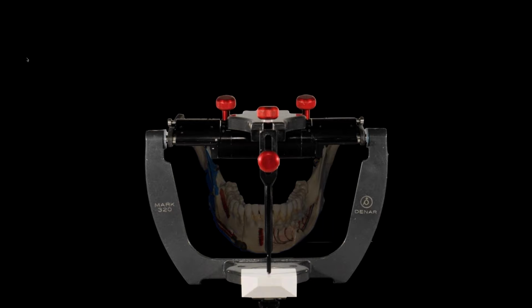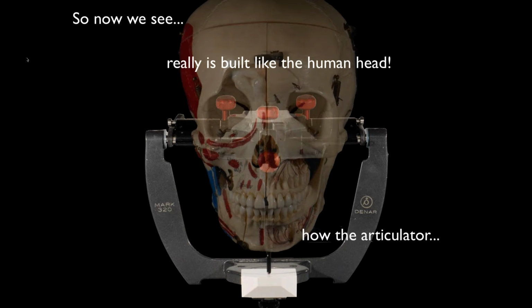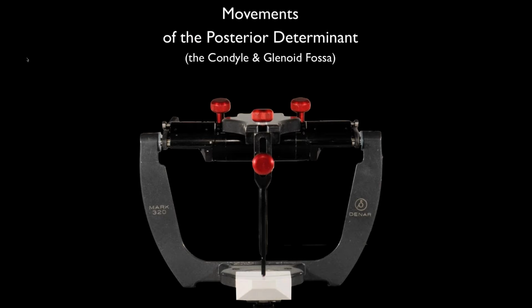So we see that when we put the actual anatomy onto the articulator, we really do have a machine that's built just like the human head, and actually duplicates the geometry of that in a way that allows our teeth to move very similar to the way they do in the actual patient, in the actual head. So let's take a look at some of these movements of the posterior determinant, the condyle and the glenoid fossa, and see what happens as we make some changes, and look at the way this movement really happens.